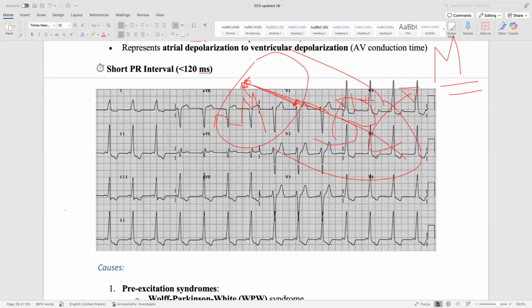Okay, now the opposite direction, a right bundle. It's coming here, normal, here, normal, and then it's going this way to the left. So where is the axis now?